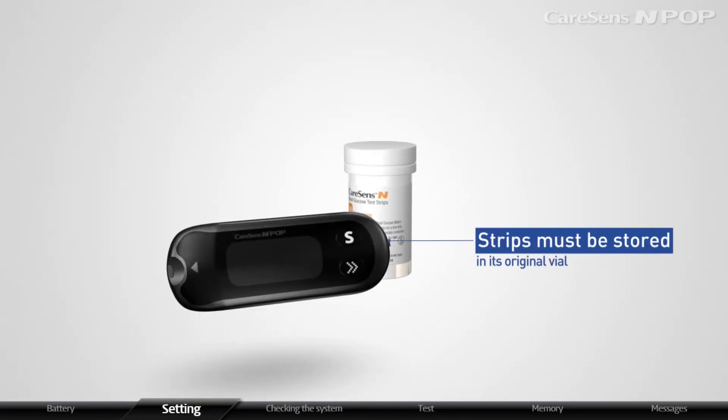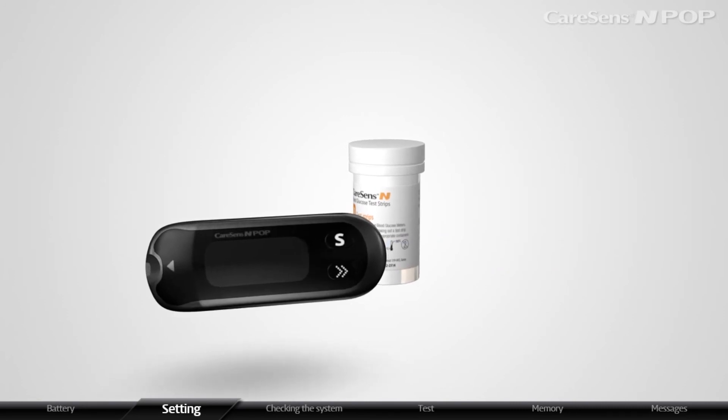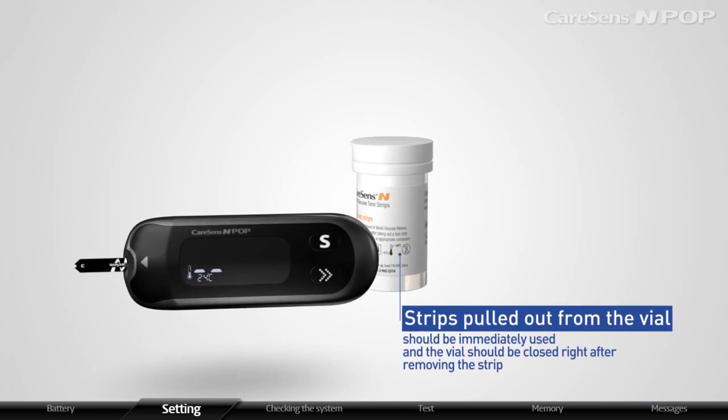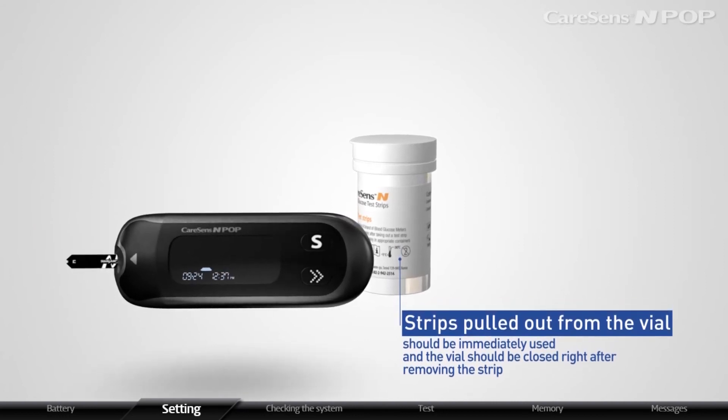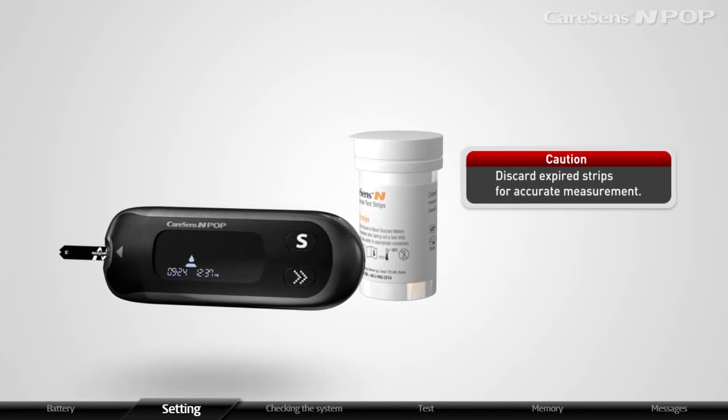Strips must be stored in their original vial and should be handled with clean and dry hands. Strips pulled out from the vial should be immediately used, and the vial should be closed right after removing the strip. Discard expired strips for accurate measurement.